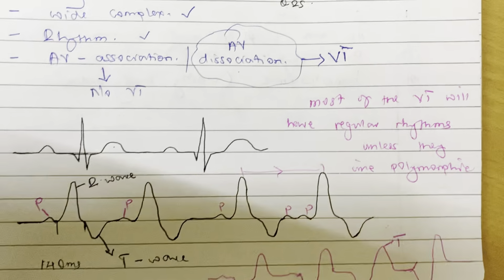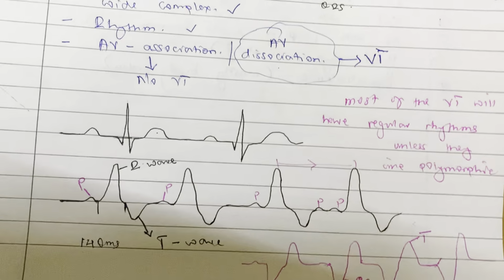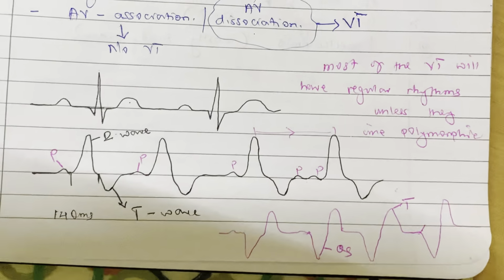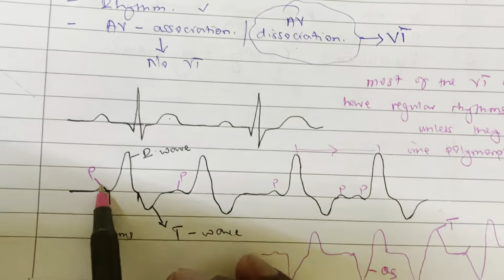This one is also a P. You have to check for association between P and the QRS. Here it is there.